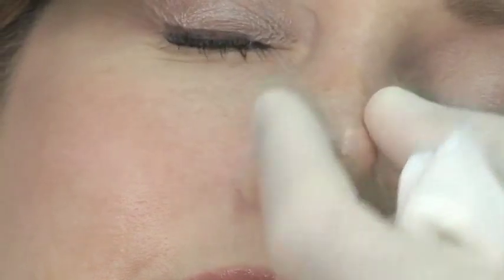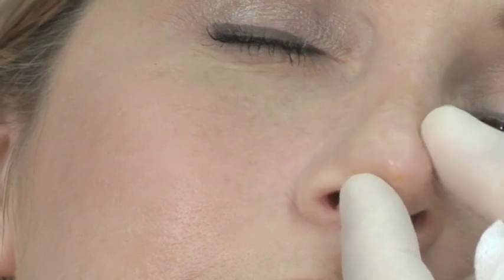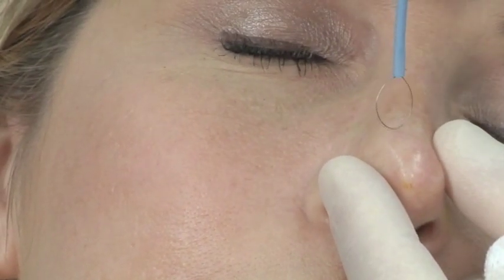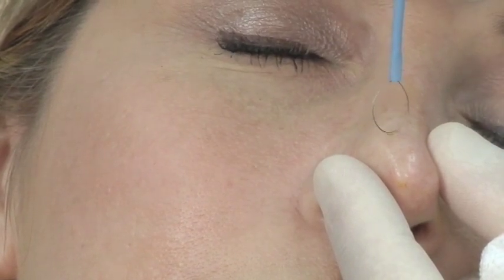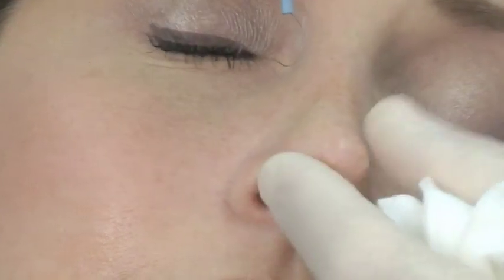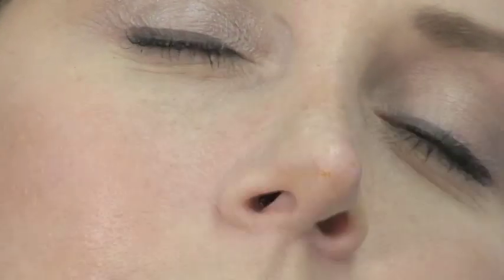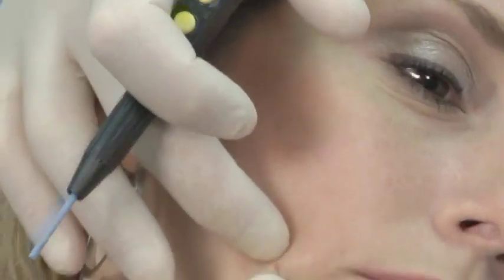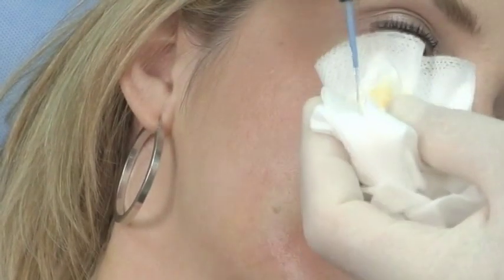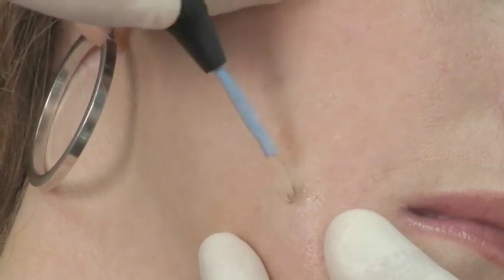This is especially good for some small areas such as the nose. Also good for syringomas and even cholesterol deposits of the eyelids, sometimes even milia. There's a little bitty lump that came up a little while ago on her nasal lobule — we're just going to get rid of it. Leanne actually had this taken off by another practitioner in the past and it's still a little bit elevated, so we're going to get rid of that elevation. If any pigment comes back, we'll take the IPL laser and remove any remaining pigment.